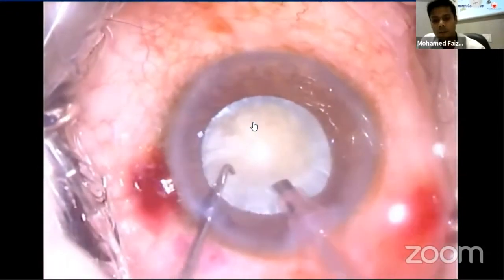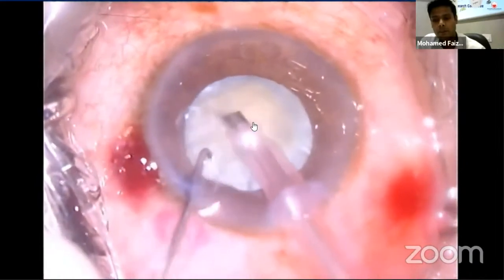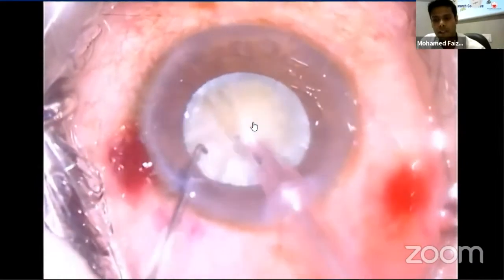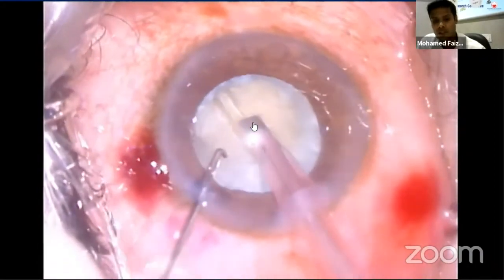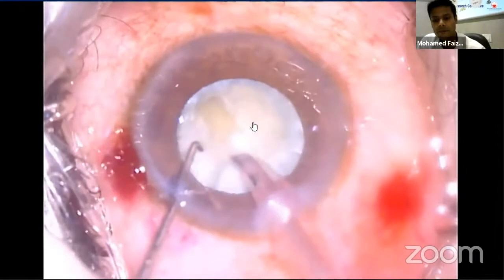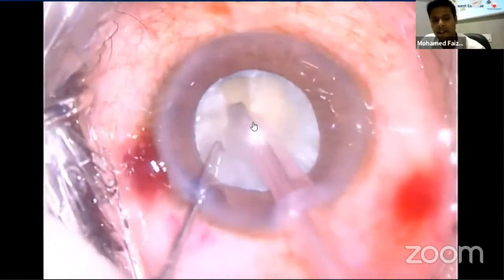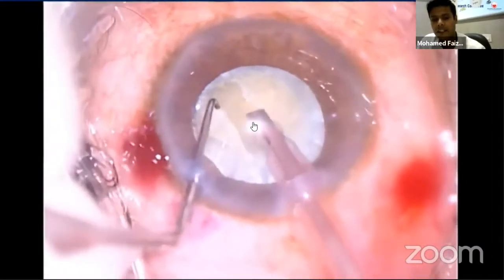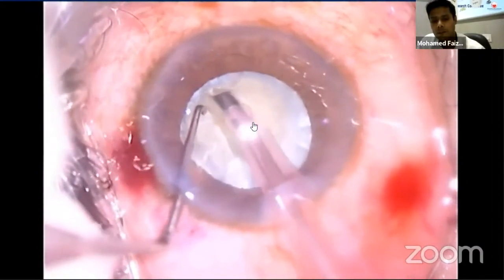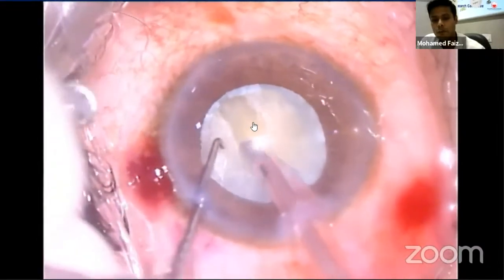The next step is to sculpt the groove in the center of the nucleus. It is started with the beveled portion of the FACO tip. During superficial groove sculpting, stop short of the rhexis; subsequent passes can be taken beyond the rhexis rim. The entire tip should not be buried — only half is buried to keep the groove uninterrupted. The groove should be 1.5 times the width of the FACO tip to prevent the sleeve from pushing the nucleus.